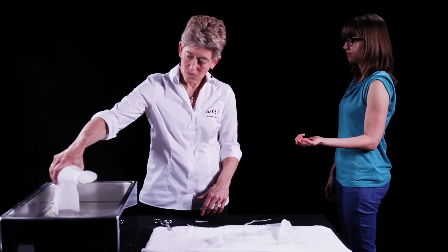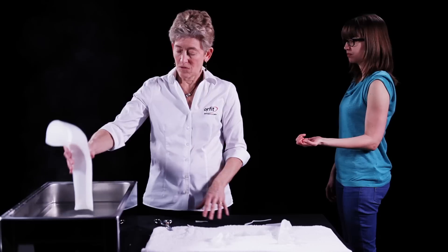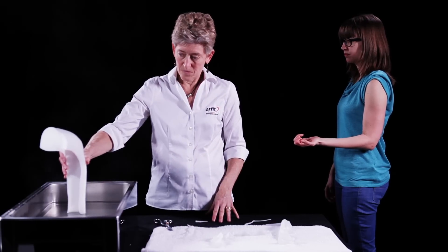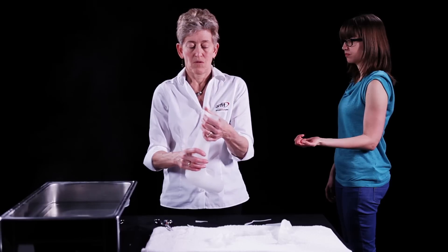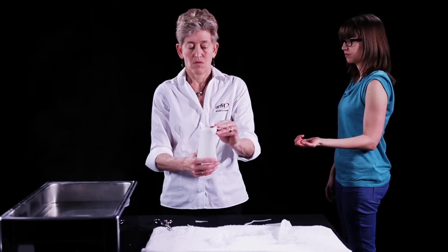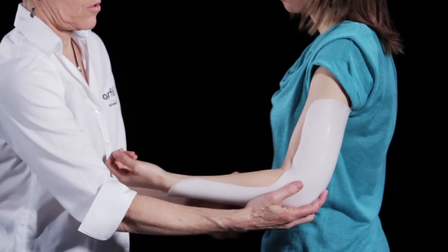Briefly re-dip the proximal and distal borders and flare outwards with the fingers. Place the orthosis back on the patient to check the fit.